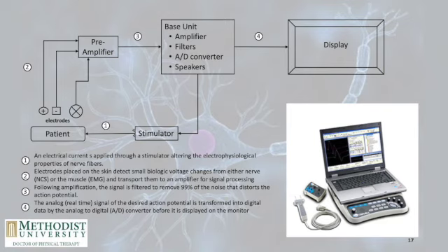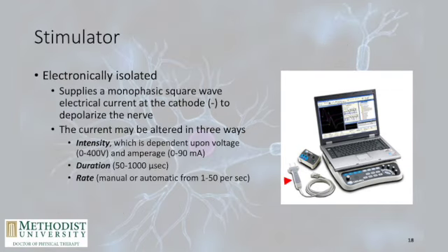So here's the equipment we're going to use, and here is the flow chart for how that equipment works. If you notice, it looks a lot like those ultrasound machines. Okay, well, obviously we're just dealing with a little different scenario here. So read through this. I'm not going to read this one to you. Just understand how that pathway works. Understand how we get the reading and where that reading comes from.